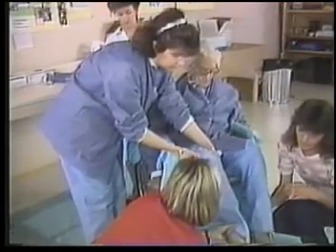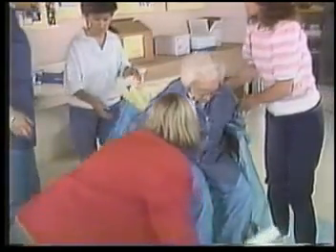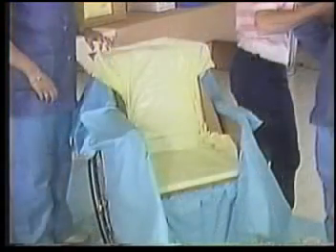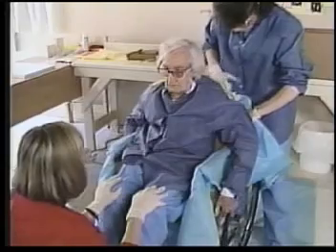Review the timing, steps, and individual responsibilities, and explain to the client what he or she may experience during the molding process. Practice transferring and positioning the client in the chair. Base cushions should be adapted at this point, so you do not have to hold the client in an unnatural position during the foaming process. For example, a wedge could be used as a base to help keep a spastic client from coming forward in their seat. While the client is still seated, check the height of the molding bag opening.